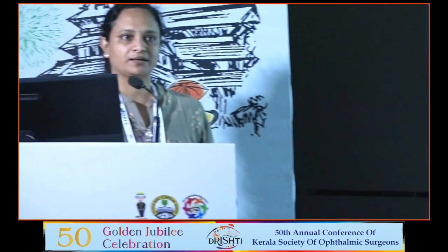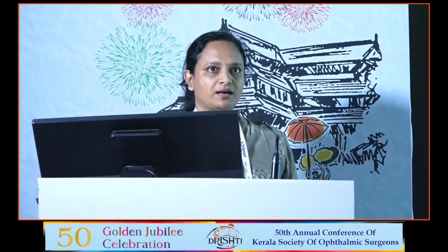Yeah, you please come. So as cataract surgeons, we are very scared of leaving any viscoelastic inside the eye at the end of surgery. We take quite a lot of meticulous time to make sure that behind the IOL, in front of the IOL, sulcus, angles, everything is washed off. But I've noticed that most glaucoma surgeons say that it is a good thing to leave a little bit if you feel that it may overfilter. So what about the post-op inflammation? Do you see that there is more?